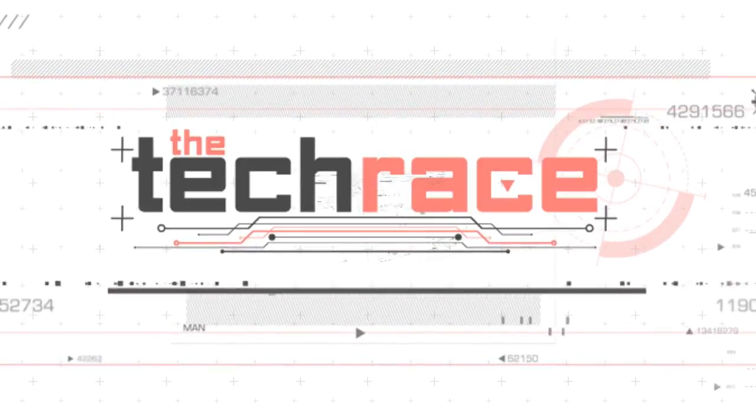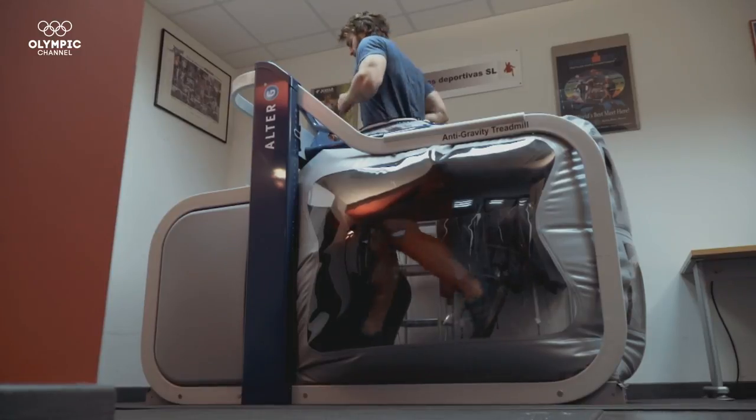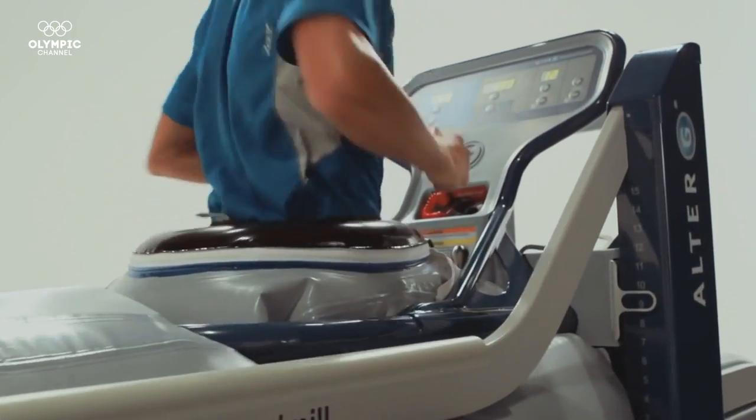Welcome to the Tech Race. Treadmills that are able to simulate a real environment, to check health and even reverse the effects of gravity. Treadmills meet high tech.